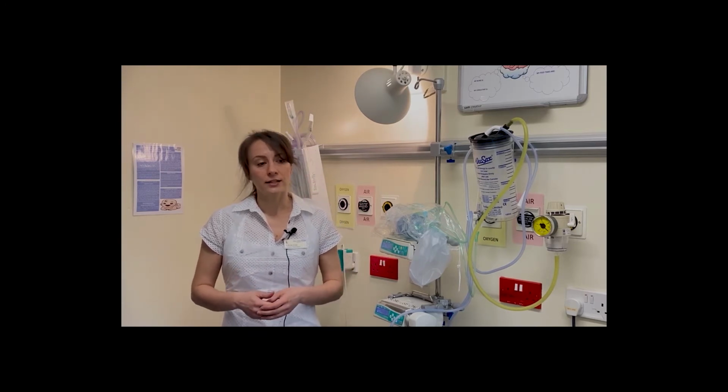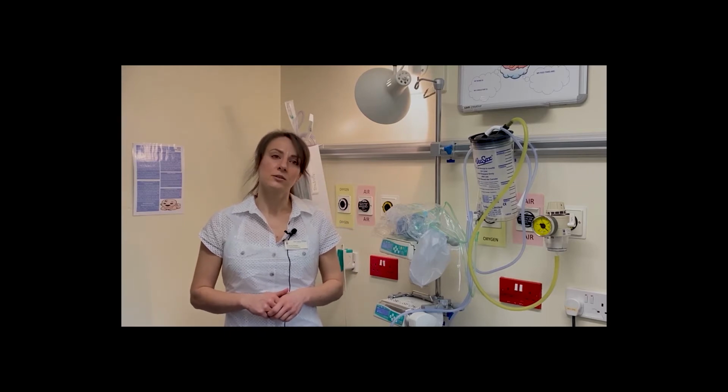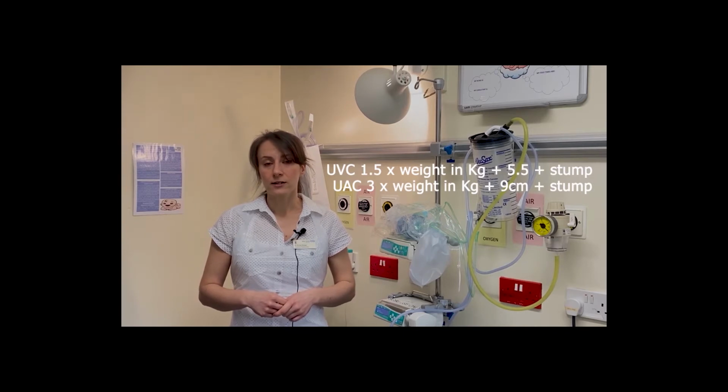Then you want to calculate how far you're going to be inserting the umbilical lines, and there are a few techniques that can help with this. There's a Neomate app that can calculate the lengths and also the size of the lines based on the baby's weight or gestation, or there are formulae available on the network guidelines.